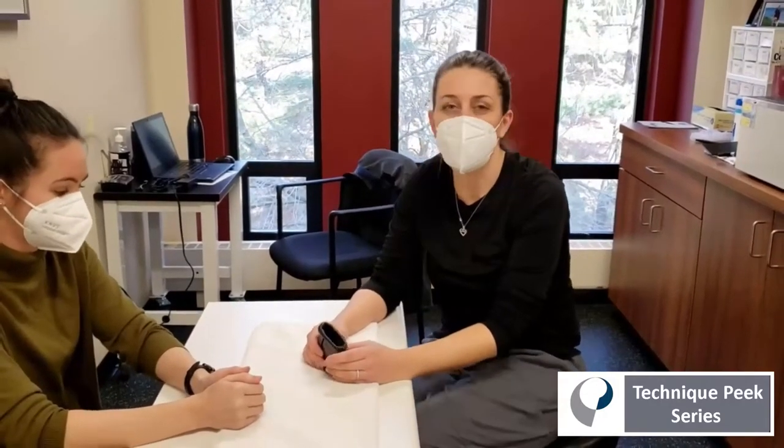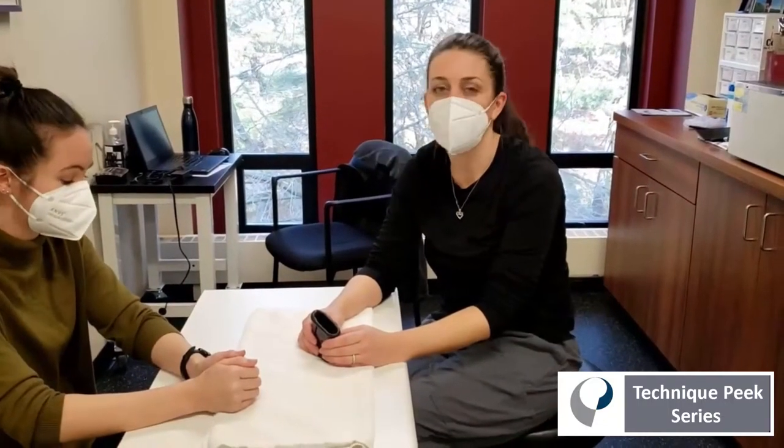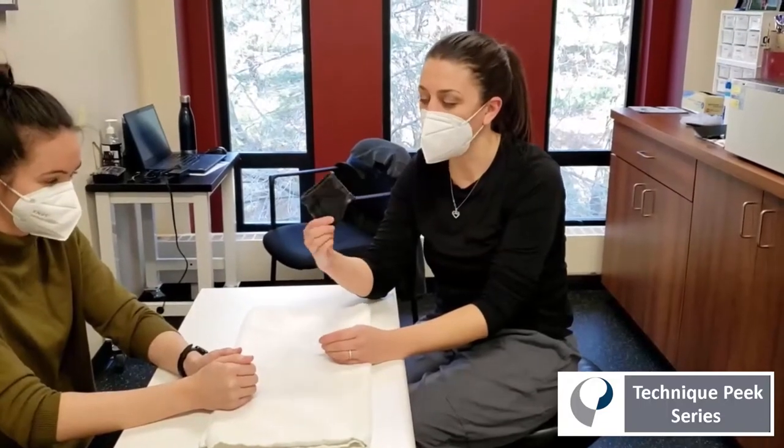Hi there. Today I'm going to show you how to make one of my favorite splints for finger stiffness, especially helpful in patients recovering from distal radius fracture or finger fractures. It's called the MCP Joint Blocking Splint.